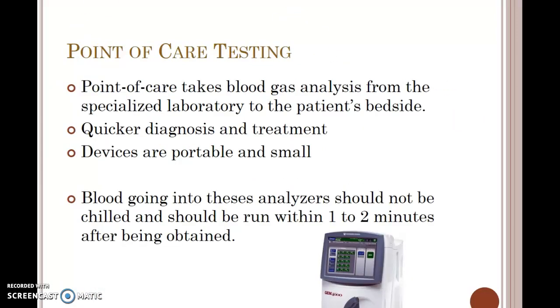Point of care testing. Point of care takes blood sample or blood gas analysis from a specialized laboratory to the patient's bedside. So this is just kind of like a portable machine. It gives a quicker diagnosis and treatment. The devices are very portable and small. And the blood going into these analyzers should not be chilled and should be run within 1 to 2 minutes after being obtained.